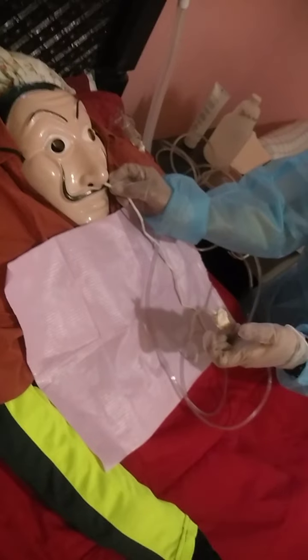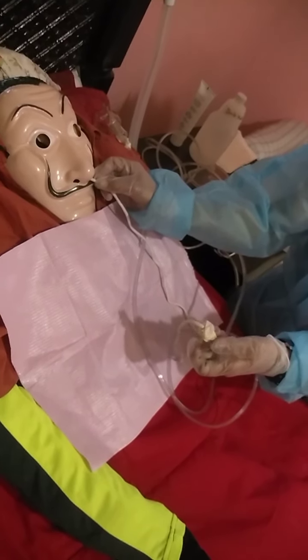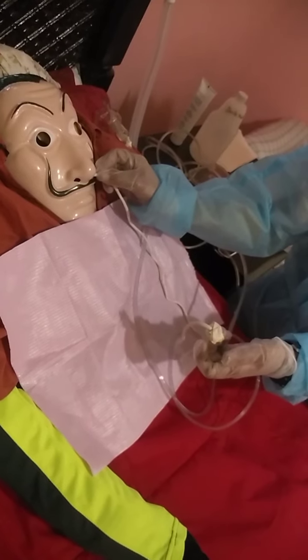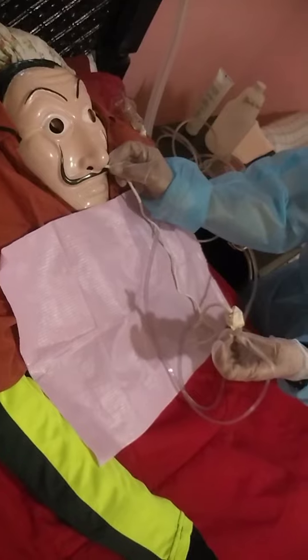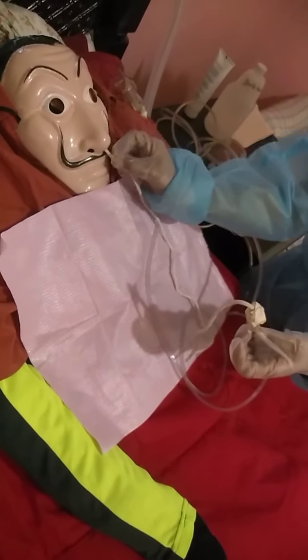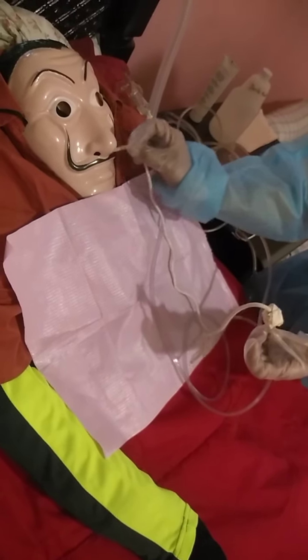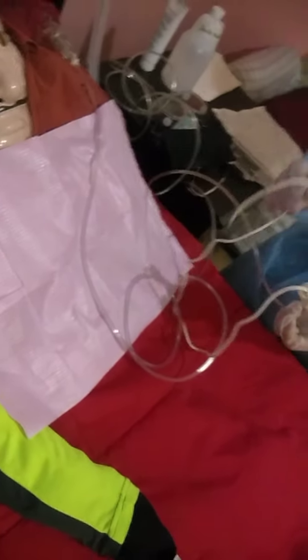Apply intermittent or continuous suction by placing your non-dominant thumb over the vent of the catheter for 15 seconds. At the same time, withdraw the catheter as you roll it back and forth between your dominant thumb and forefinger. Then encourage the patient to cough.